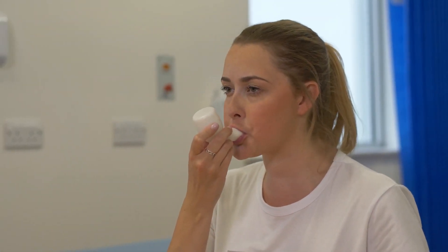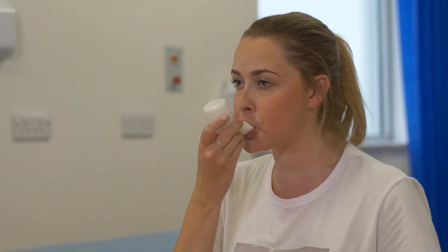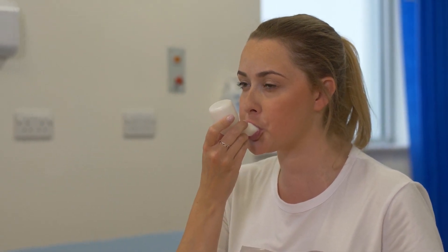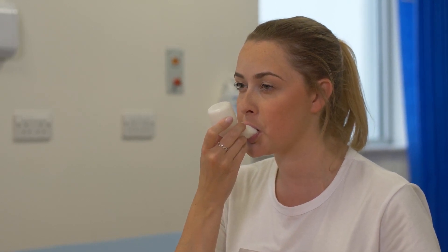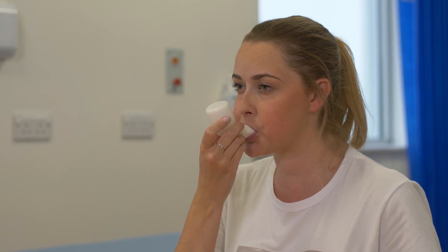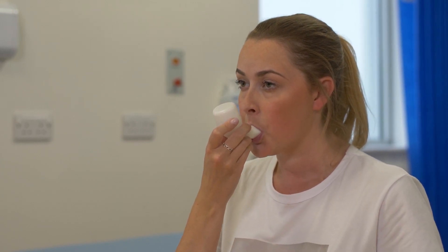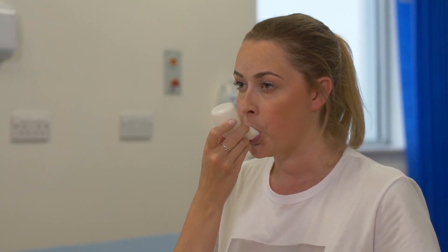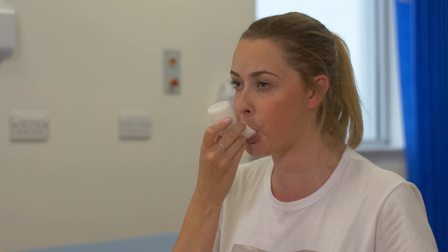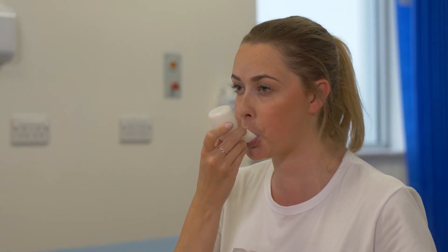Once you place the device in your mouth, take a slightly bigger than normal breath in. On breathing out, your breath causes the ball to rise and fall, creating a vibration and fluttering effect. Try to keep the effort of your breath out consistent. The mouthpiece should be held at right angles and towards the end of the breath out should be gently tipped up to increase pressure.